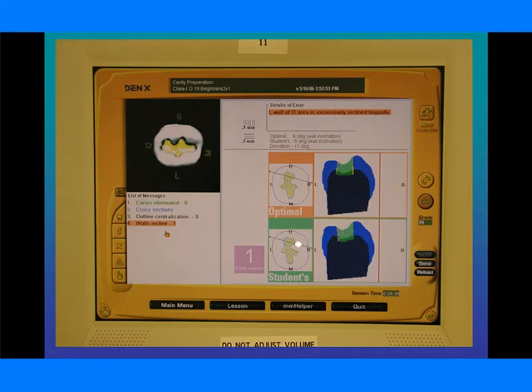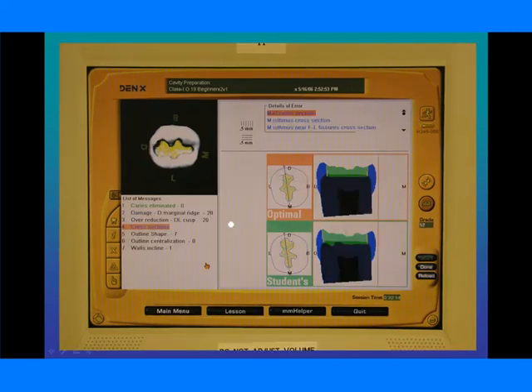Okay, but what happens is if you go in and you get a little bit too aggressive, what can happen is this. You can start taking too much and you start getting over reduction errors or damage to the distal marginal ridge. We've gone into the distal marginal ridge here too far. You can see it here. You can start having points deducted. Now I've gone from a 99 to a 52 in the blink of an eye. So we always want to make sure we be as conservative as we can as we're cutting, especially at the beginning.